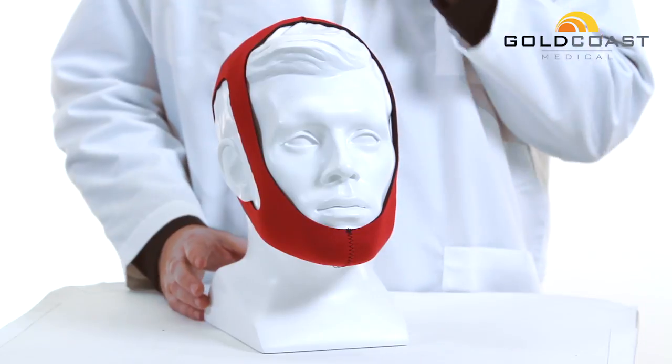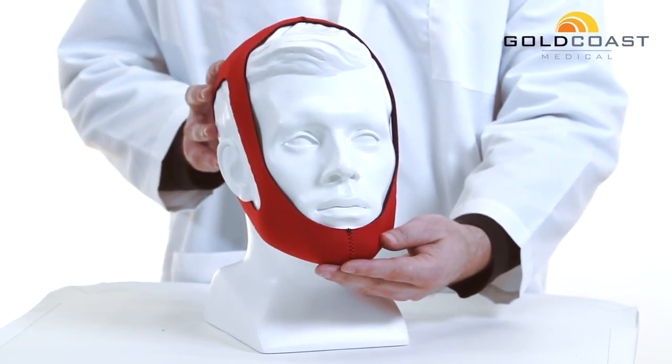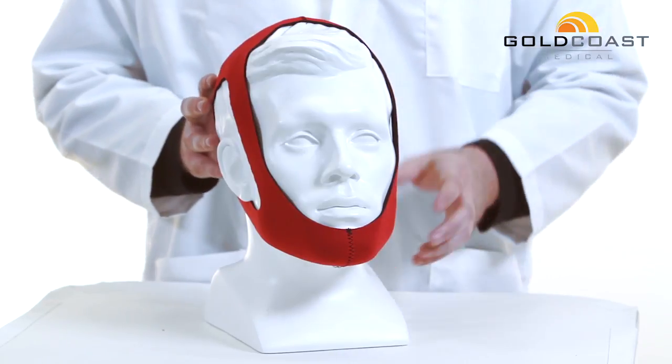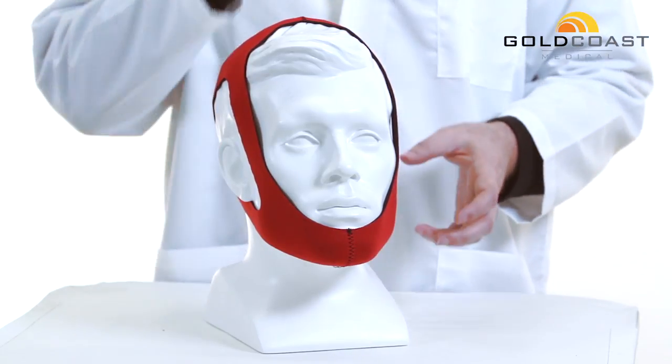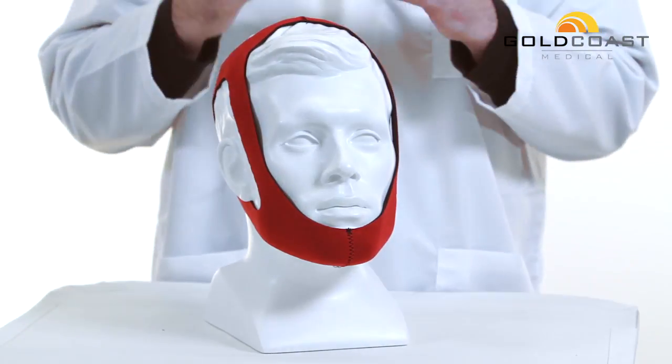This will also minimize your oral or nasal dryness. You can use a chin strap like this as an alternative to an invasive full face mask, because you will not have to worry about the air escaping through your mouth.